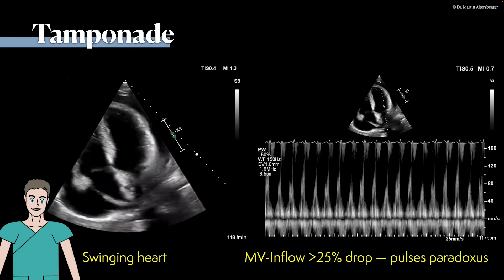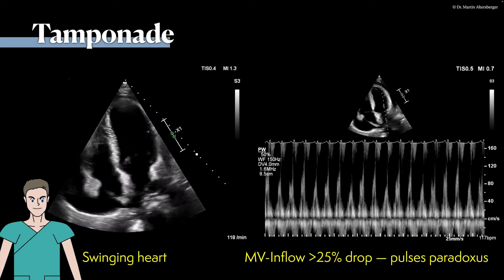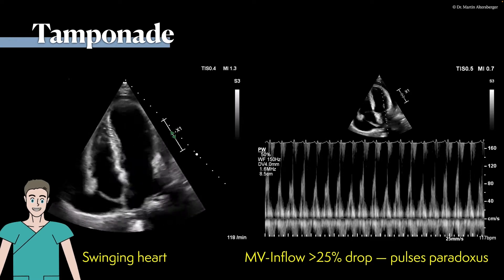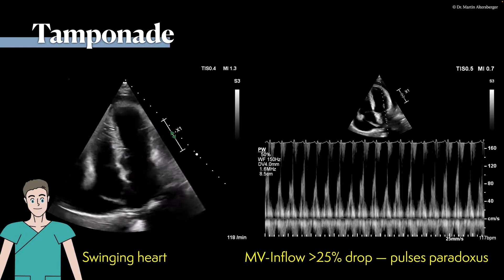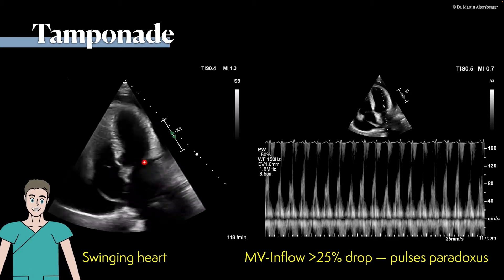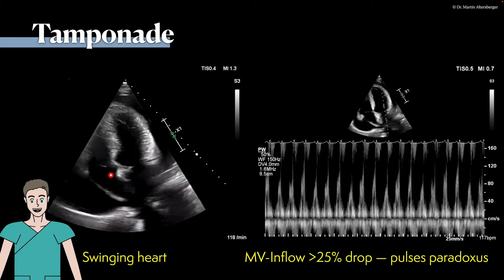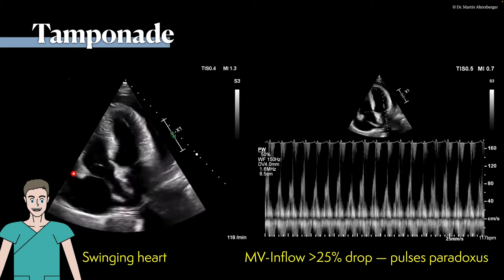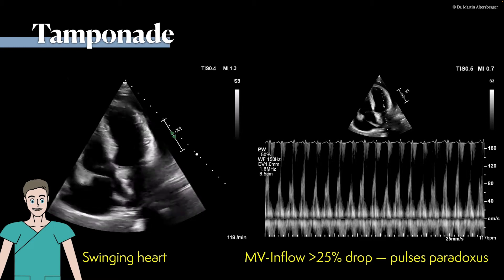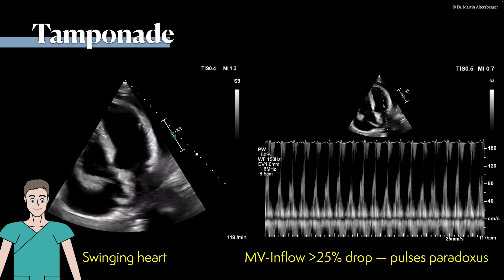I want to show you some pathological findings which you have to think about when you see a patient in an emergency situation, for example with dyspnea. In this case, we have an apical view of the heart. We see a four-chamber view: the left ventricle, the right ventricle, the right atrium, and the left atrium. It's quite striking that there is a whole lot of free fluid — a so-called swinging heart. In this case, it was a tamponade.